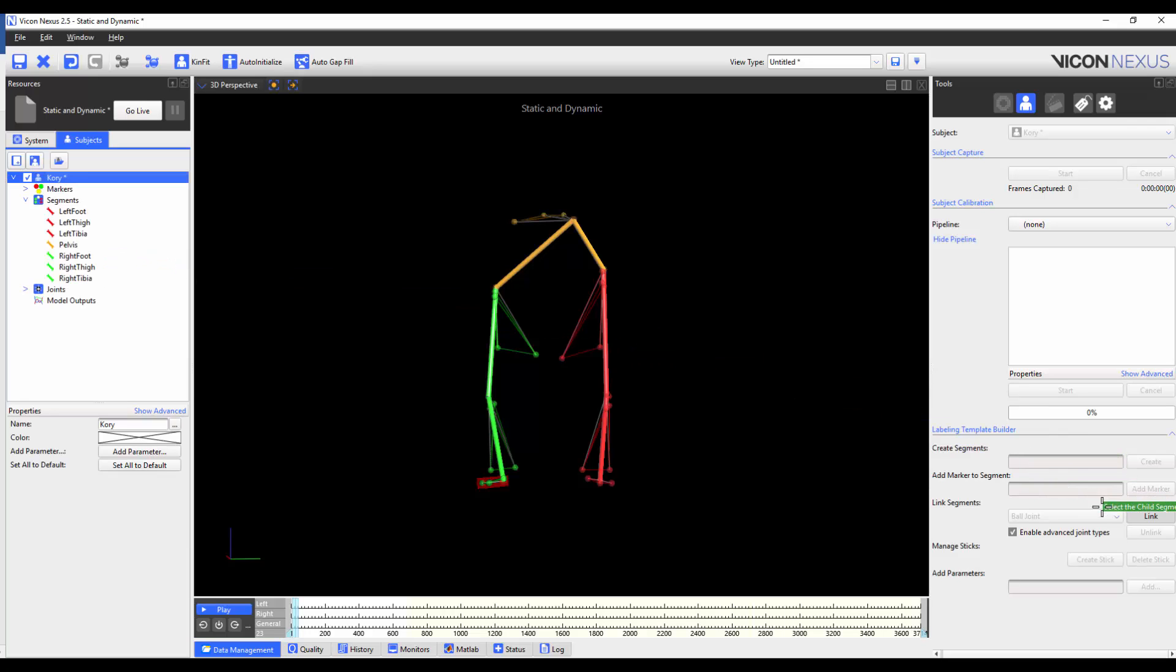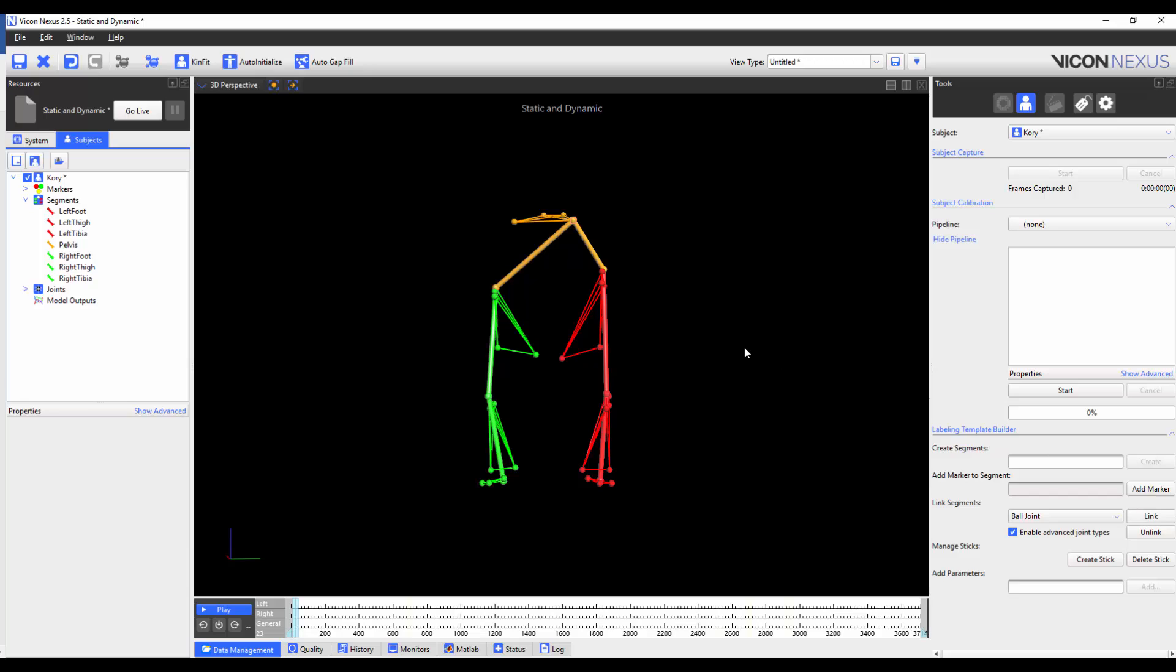I press link to close the loop. Now that all segments are linked, we can see that the subject name is in black and this is now a good point to save the VST.